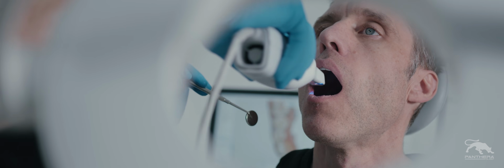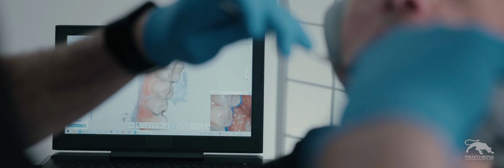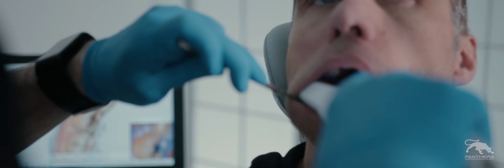Ensure the quality of the print by checking the items mentioned above. If some areas are missing or unclear, go over them again. The device should make the corrections.